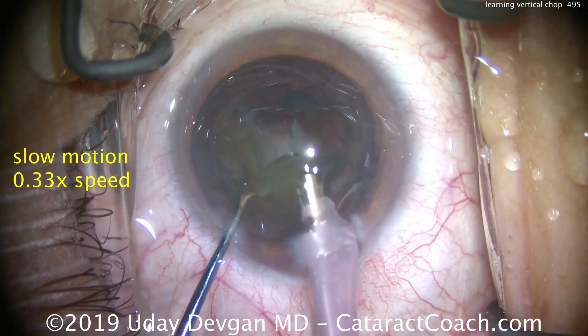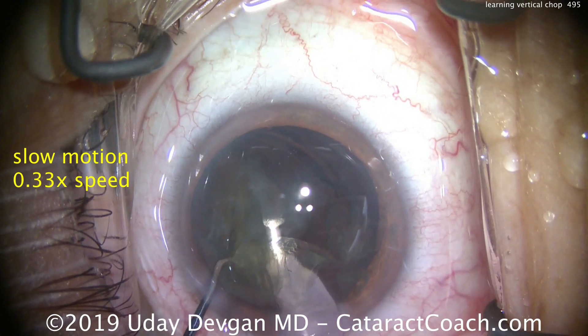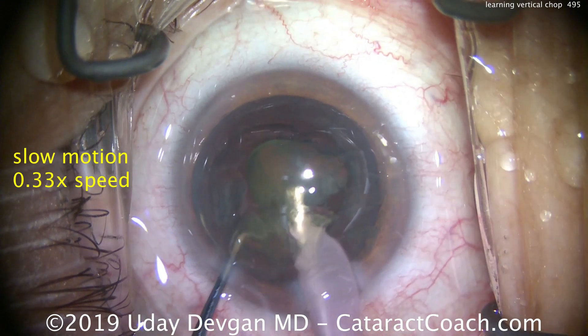The remaining quadrants deeper in the capture bag will naturally just flow towards the tip of the phaco probe, and then we'll emulsify those as well. If we want, we can further sub-chop them, or we can just use the probe to emulsify, keeping the probe in the center of the eye and using the chopper to push the pieces centrally.